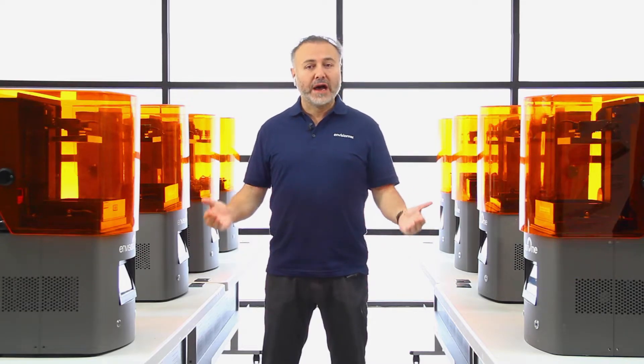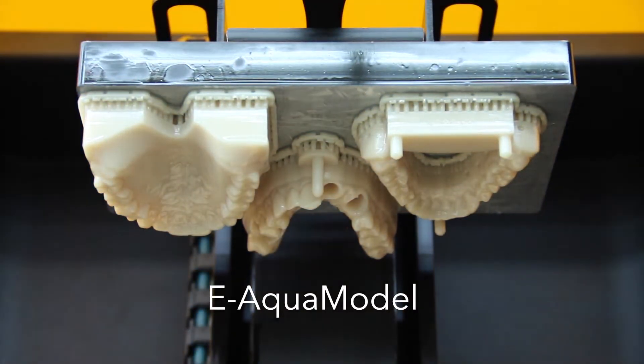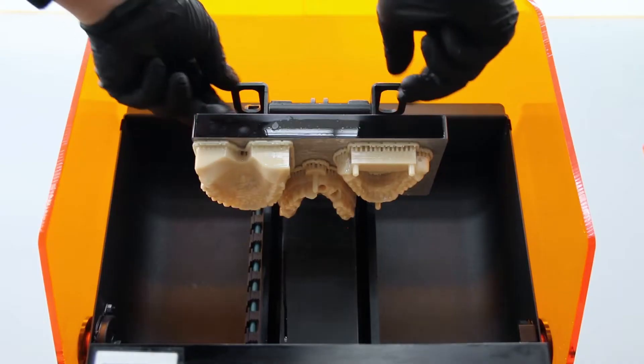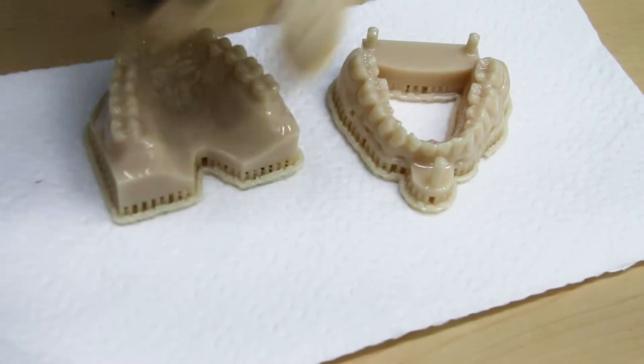At EnvisionTech, we are proud of our commitment to delivering green solutions in 3D printing. The E-AquaModel is our entry into what we call the 21st century digital dentistry solutions that will make the earth greener and safer.